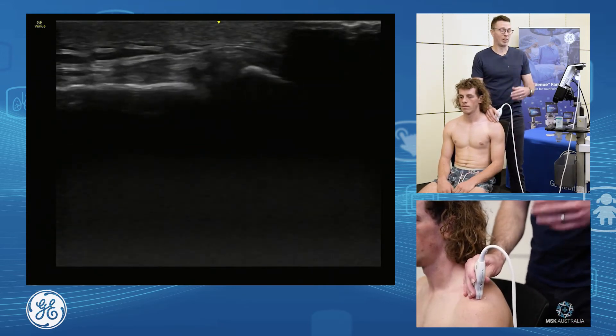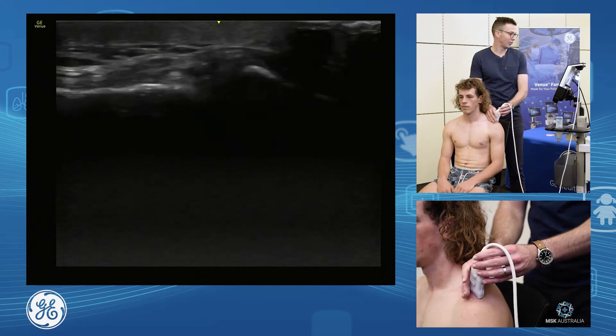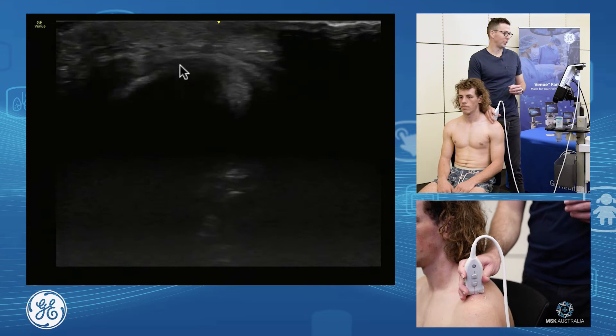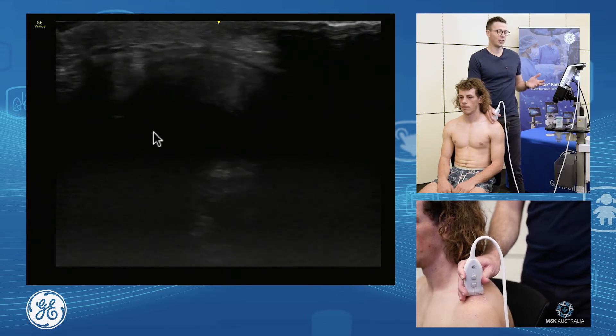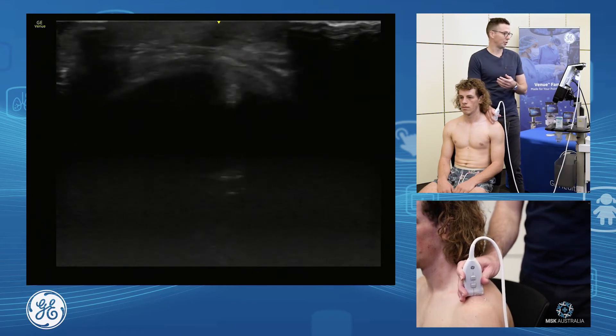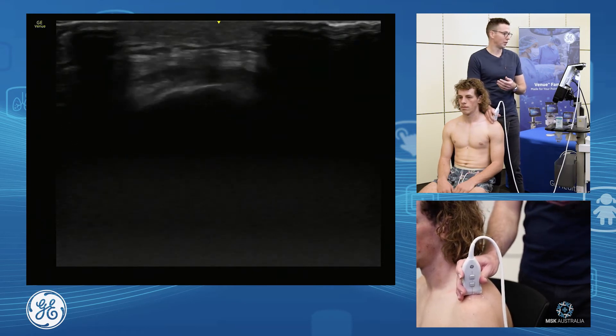From the AC joint in long axis, we can also assess it in short axis. As we get in through here, we're now short axis on the joint. We see that circular nature of the joint, we see our rotator cuff sitting down below. As we fan our probe more medial, we're on the clavicle, and as we get lateral, we're on the acromion.